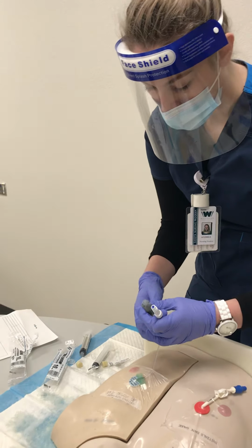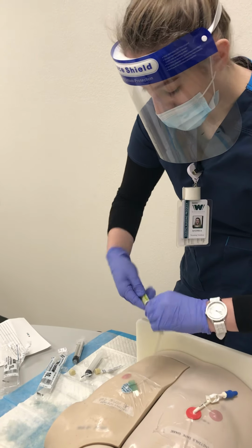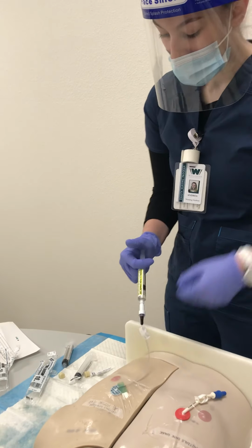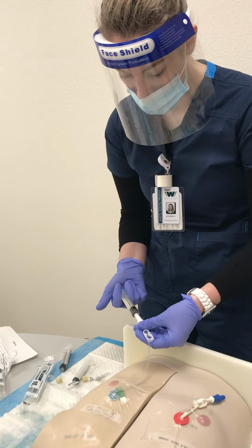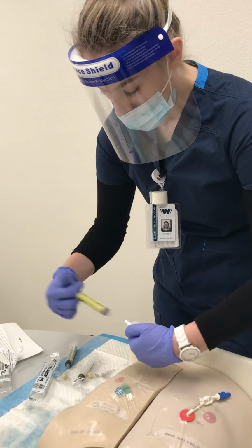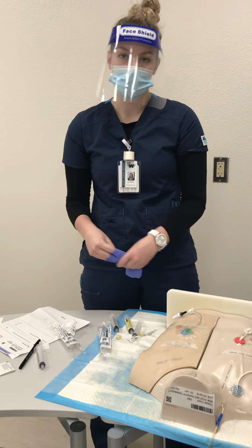So we can do that and get the air bubble out. And then attach this. Now if I were to ever break aseptic procedure and touch the end of the port, I would need to clean it again, but I have yet to do that, so I'm going to unlock this. And a push-pause method for this as well, until it is administered. Okay, so once that's administered, I'm going to want to lock it again, and unhook this and clean up my workstation. And I'm going to probably want to stay with my patient, even though they've had ceftriaxone before, for about 15 minutes, just to make sure there's no allergic reactions.